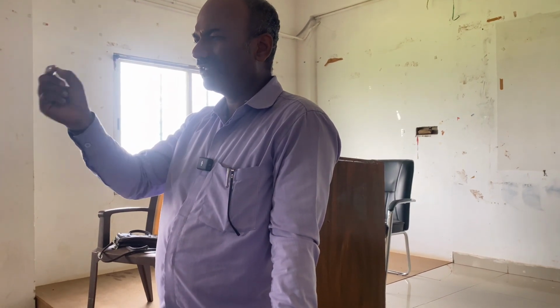Direct distance ophthalmoscopy is used for identification of the glow, right. So our eyeball is a closed cavity. It's a dark closed cavity with a small central hole called the pupil, right.